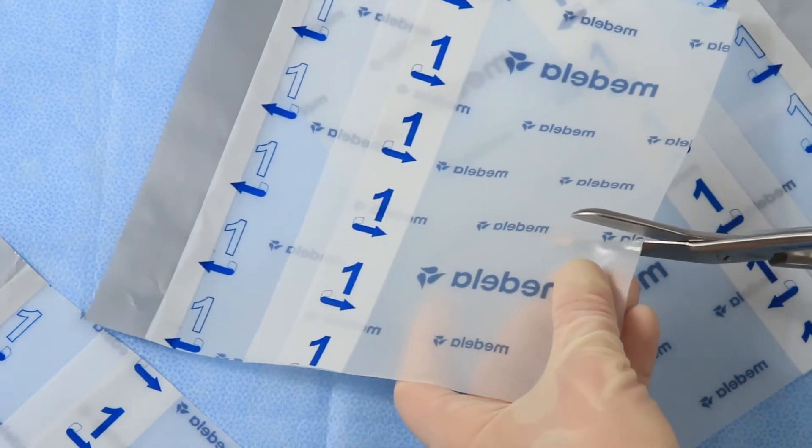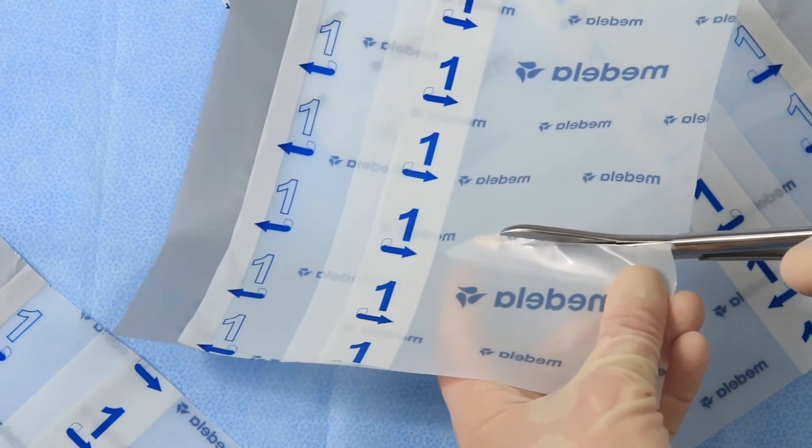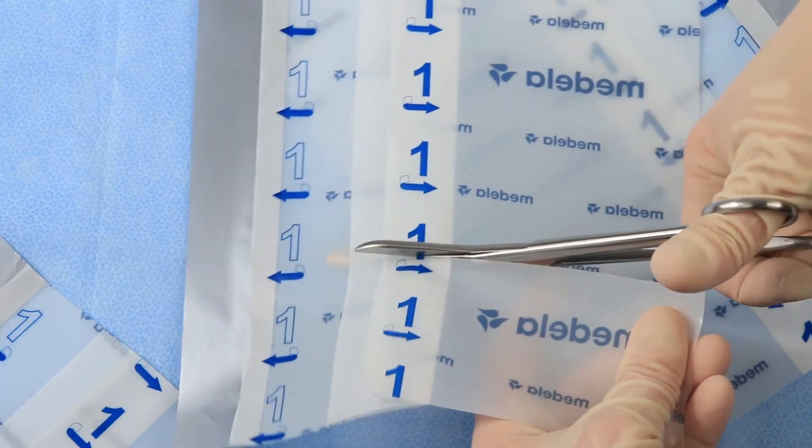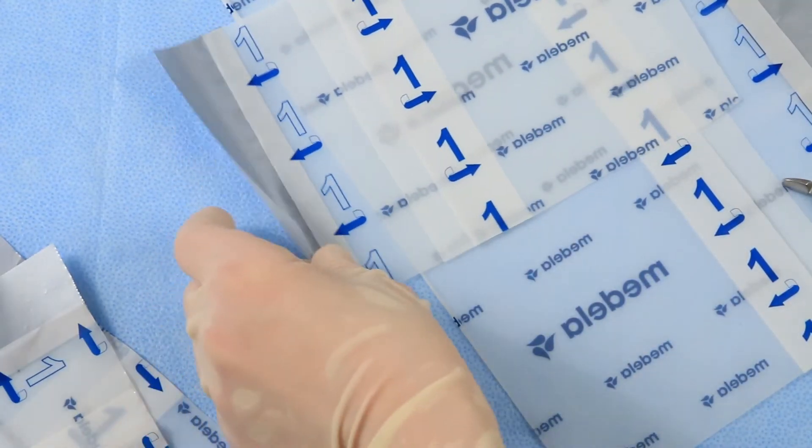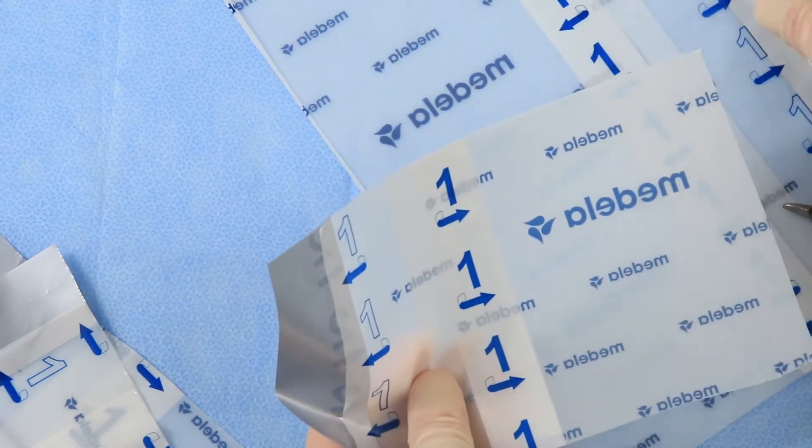There are two common ways to cut the transparent film: it can be cut in either strips or squares. Make sure to retain a portion of the silver-colored handling bar on each piece.